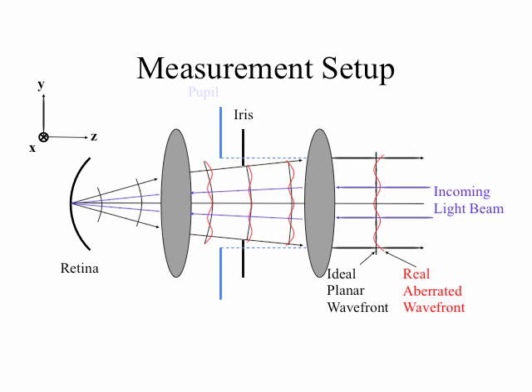But every time that we examine someone else's eye with a direct and indirect 78 diopter lens, of course, we're illuminating the retina, and as such, every point in the retina that we can see has photons coming out of that point, diverging, coming out of the eye, so that we can image the retina on our own eyes or on our cameras or whatever it is that we're using. So this is an example in this slide here of a retina that we're illuminating, and we're looking at rays of light coming off of the patient's retina.